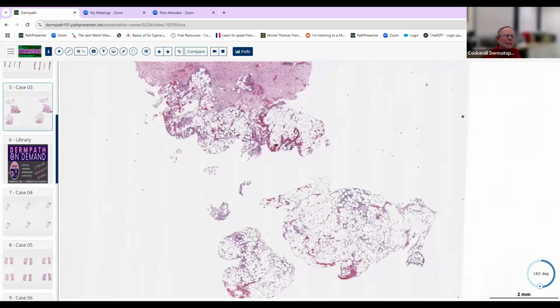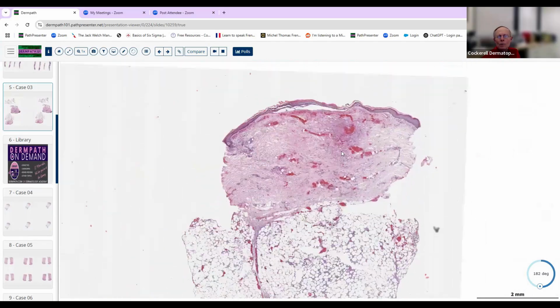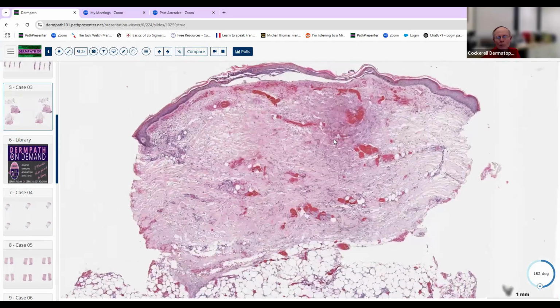Usually it doesn't have quite the degree of inflammation, because most people who are in a coma and sleep outside don't usually only sleep outside for one night. If they sleep for longer than that, they usually are dead. So you usually don't get this degree of inflammation and vascular thrombosis. Then it's usually just epidermal necrosis with maybe some sweat gland necrosis, because it's relatively acute.